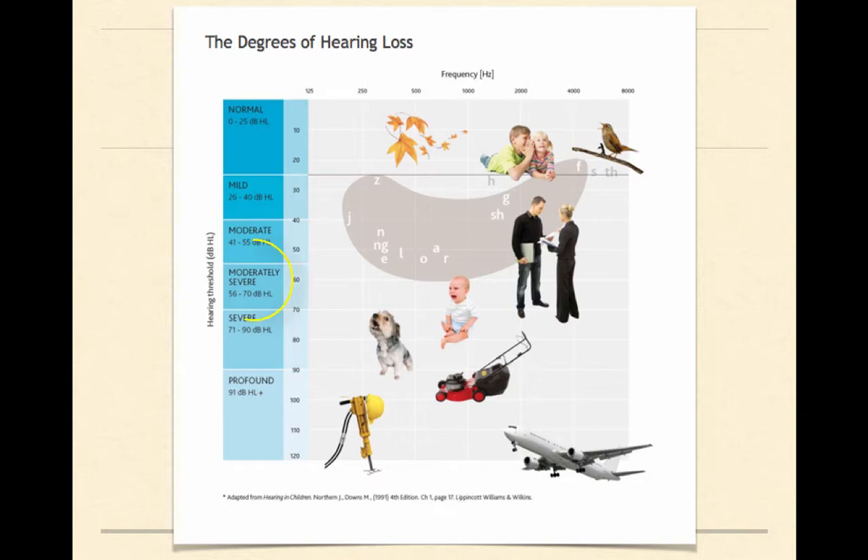But as you move down into maybe the moderately severe range, you're not going to be able to hear any of those things, because you can only hear the sounds that are below the line indicated on your audiogram.